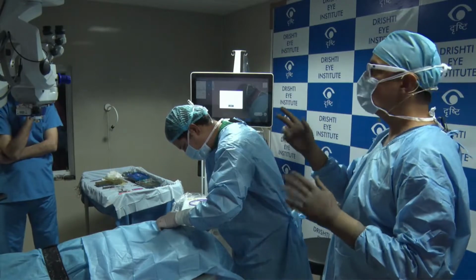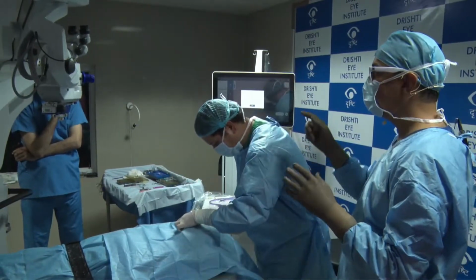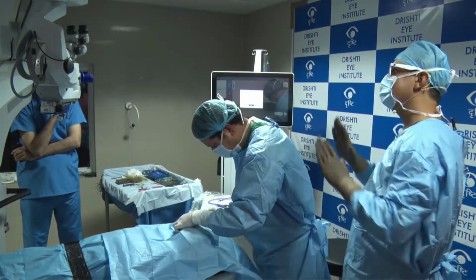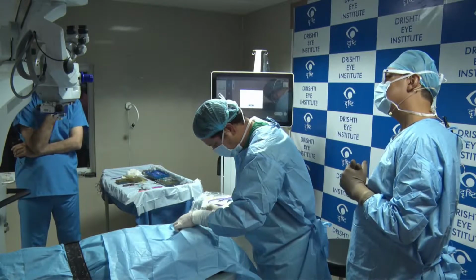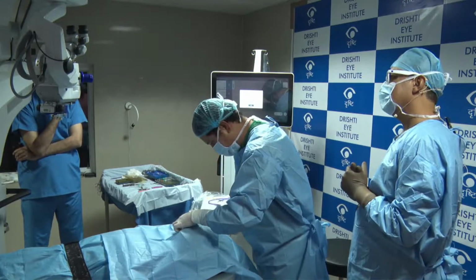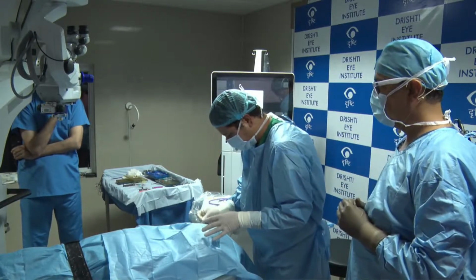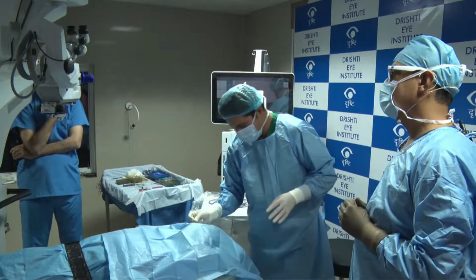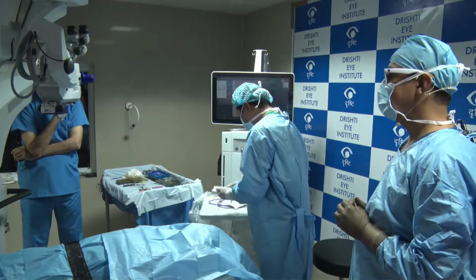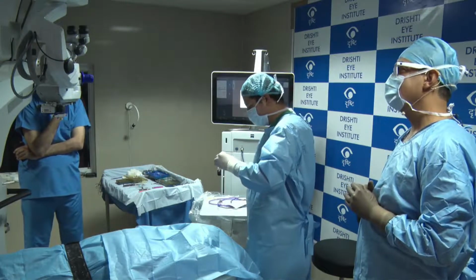Here, you can switch. There are certain times when you don't want to see 3D and you want to see the normal view. You don't have to wait for it to be switched, you just have a small button, you flick it, and then you can start using it. I think that's a very big advantage with this machine, and also I believe there's a little bit of lag. The lag in this is much less. I use the Alcon system also, because that's basically designed for posterior segment. For anterior segment, sometimes you feel that it slows you down a little bit. You have to be slow, deliberately.